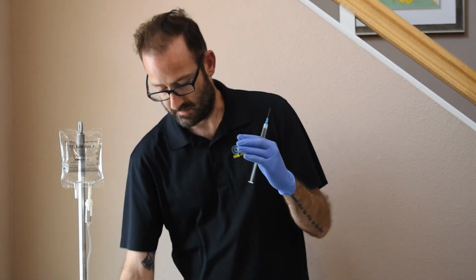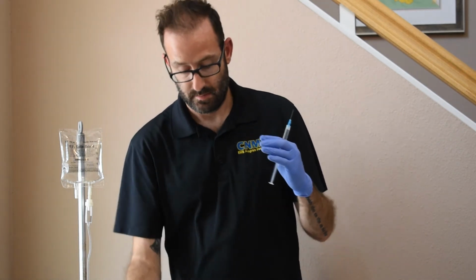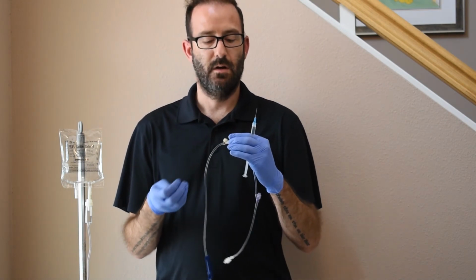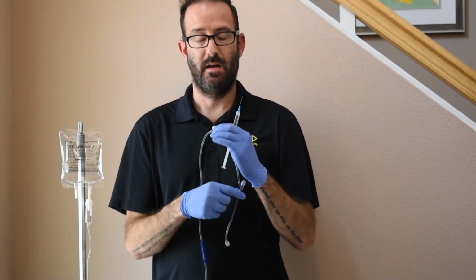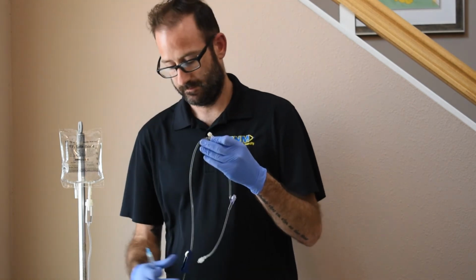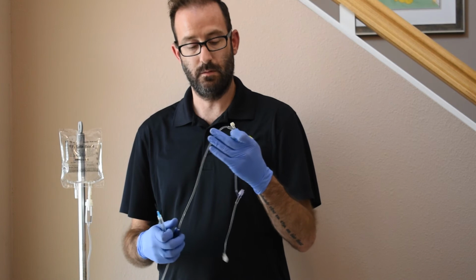Holding that, I'm going to take my alcohol pad, and I'm going to show you both ways now of how you can do this with a needle port and a needleless port. We're going to clean our needleless port, shut down our flow.